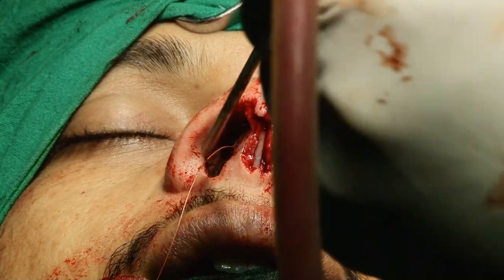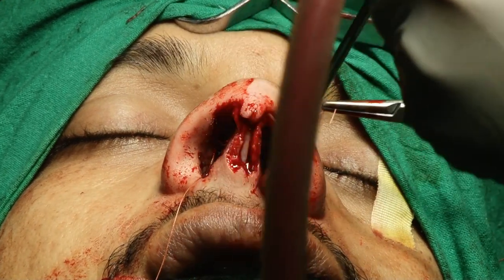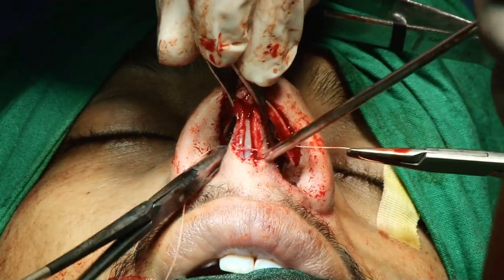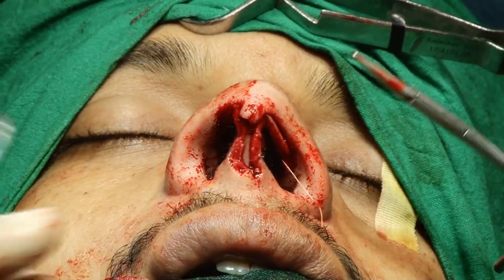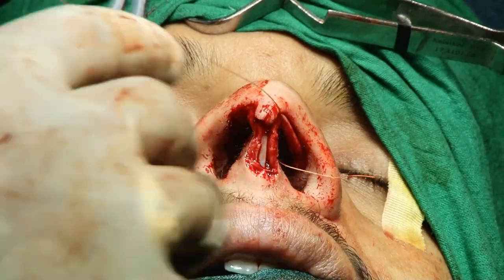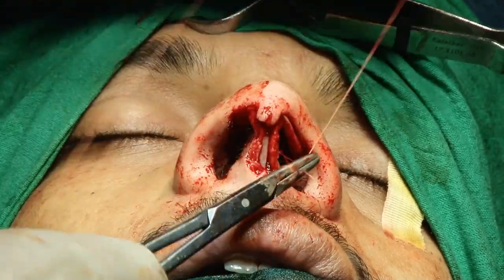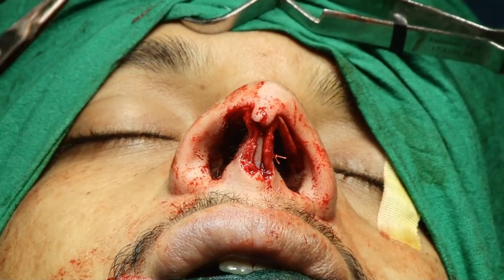Sometimes some patients have only a deviated caudal part of the septum, with asymmetrical nostrils, and the patient doesn't want a rhinoplasty. In such a case, you just create a pocket and then fix it inside. Never cut it and remove it, because then the patient can develop a droopy tip.